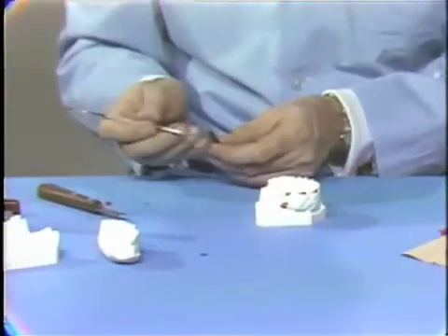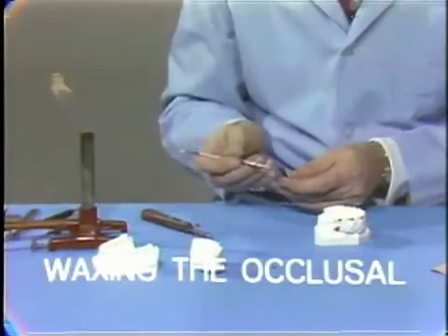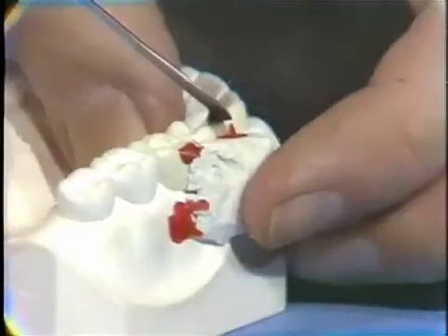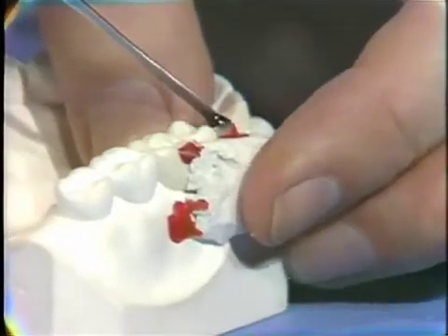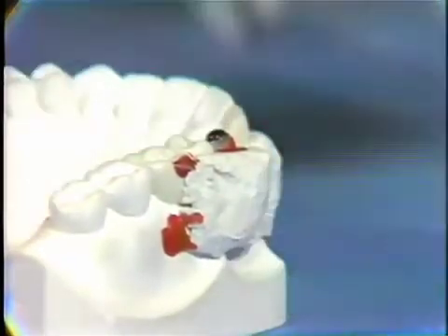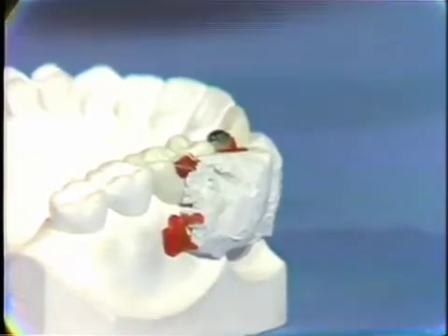Any suitable waxing technique can be utilized in this particular situation in the handheld model. It doesn't lend itself to any very complicated waxing procedure. The tooth has come loose, so I'll just have to re-tag it on the labial surface with a little more wax.